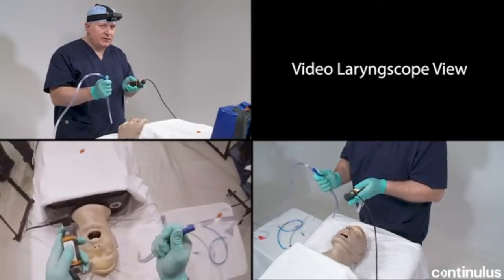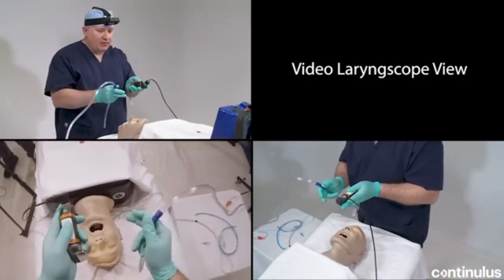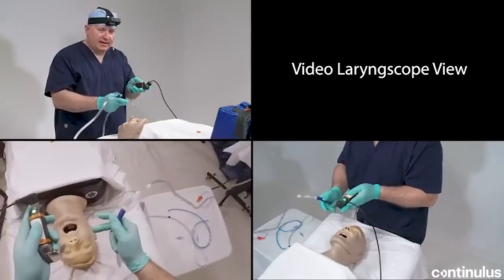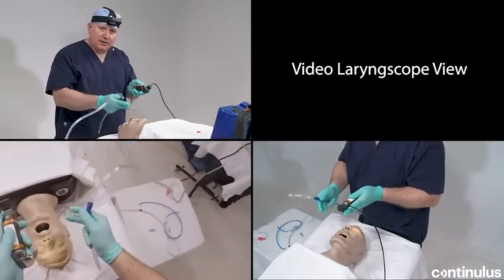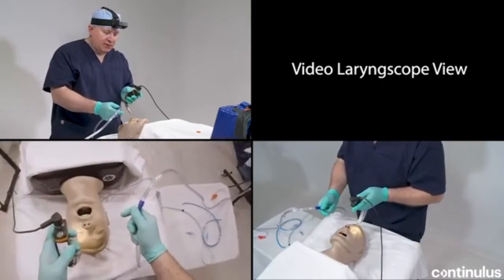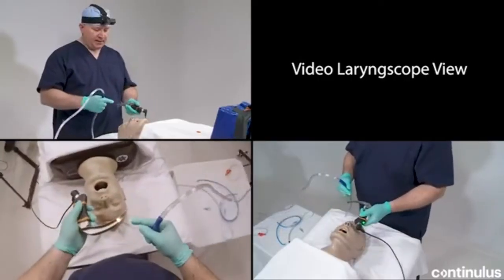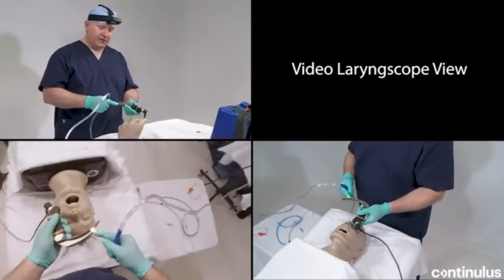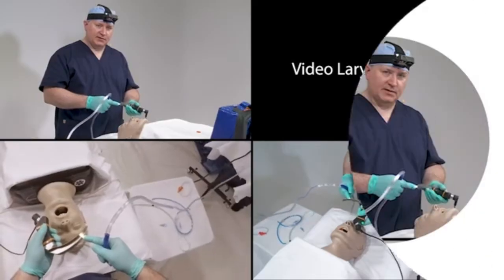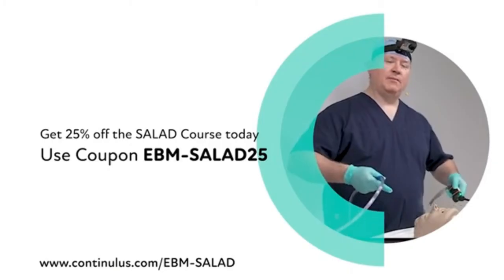This is going to allow me to do an easy insertion of the laryngoscope blade, hugging the base of tongue, staying above the posterior pharyngeal wall, staying above the palate, so that I allow gravity to have the residual airway contaminant pool to the gravity-dependent posterior pharynx. If I scrape the posterior pharyngeal wall as I'm coming around the base of the tongue with the laryngoscope, I'll pick up airway contaminant, in this case artificial blood, onto both the light source as well as the video source, and I'll have to stop, wipe that off, and begin again.